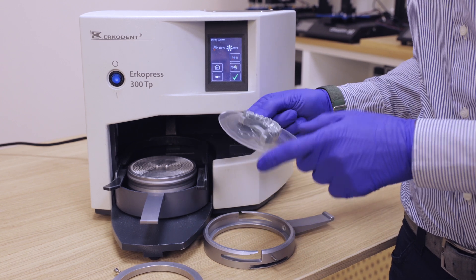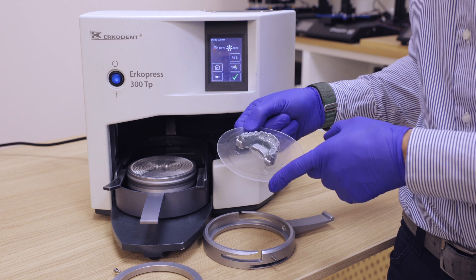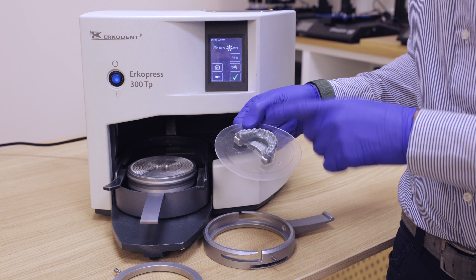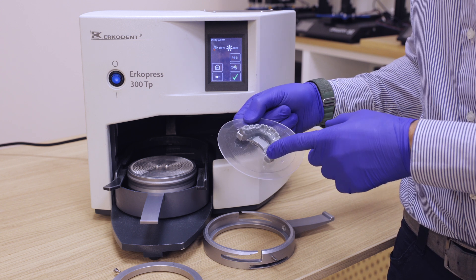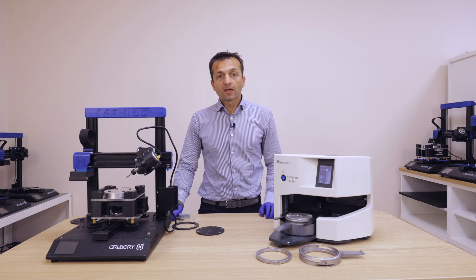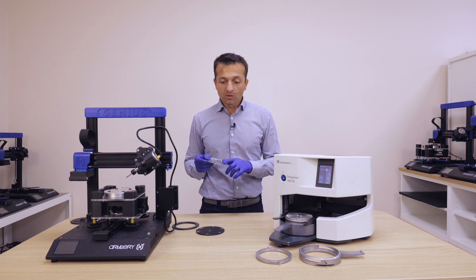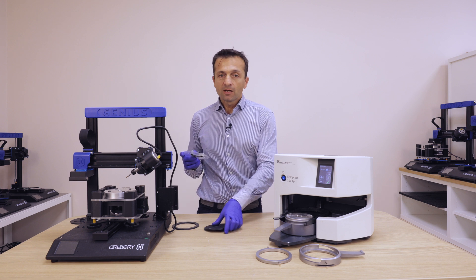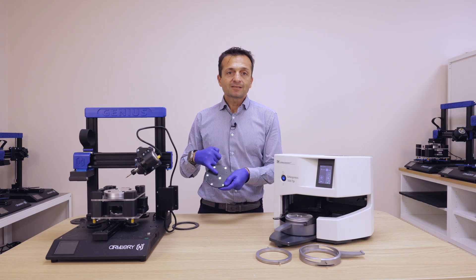The model is now thermoformed. We are ready to put this model on our trimmer and cut the trim line as we designed in our software. This is the workflow to thermoform your model. Now the only thing you have to do is transfer the model to the trimmer using the same pins.